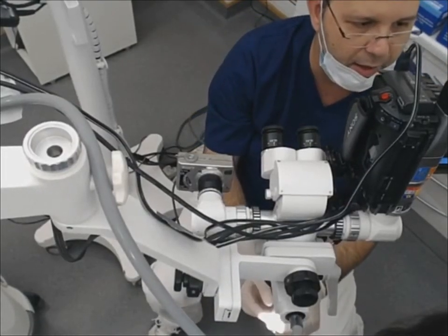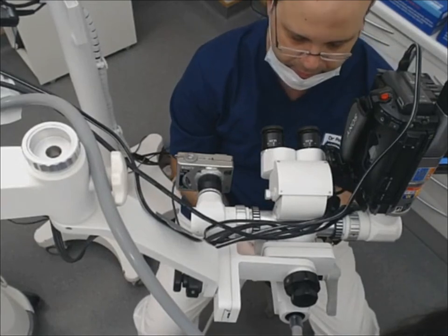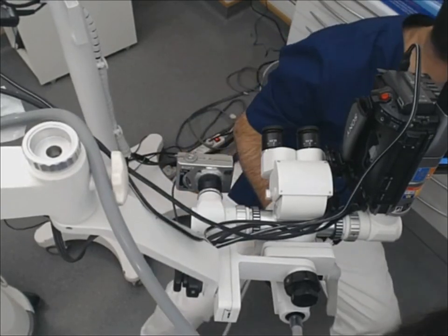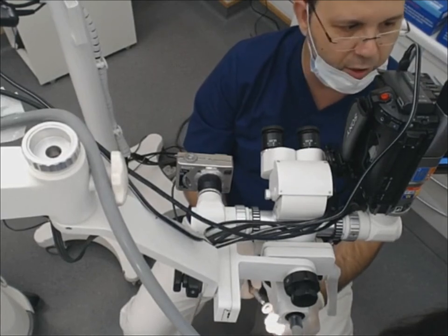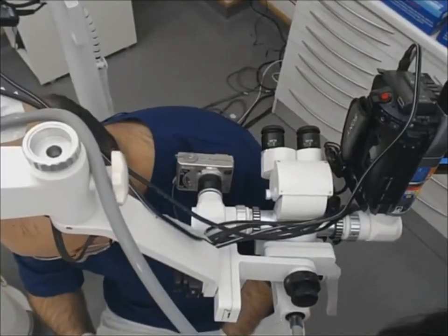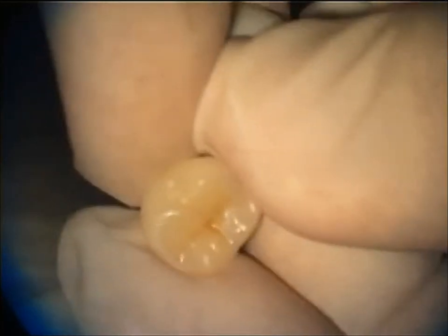Okay, like you see, it's almost finished, so I just need this wheel, which I showed you before, and on the occlusal side I just pass again a little bit. Okay. And then we have our restoration done. Okay? So you see, very natural.